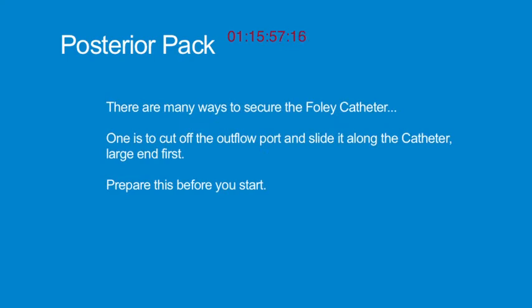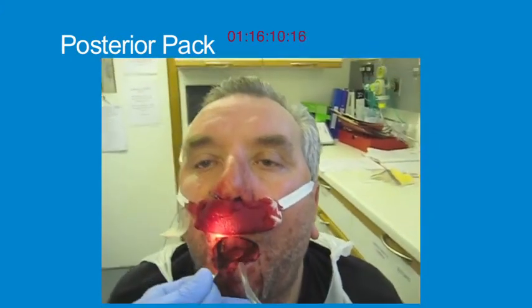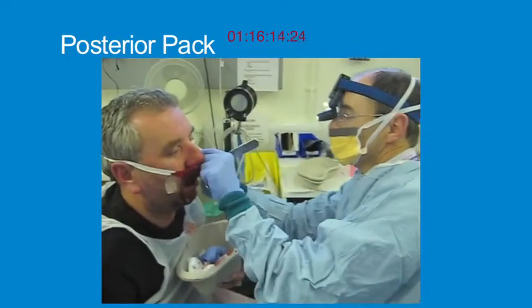There are many ways to secure the Foley catheter. One is to cut off the outflow port and then slide it along the catheter large end first. Prepare this before you start. Keeping the head level with the floor of the nose in the horizontal plane, examine the throat and remove any clots which may be seen hanging down from the postnasal space.